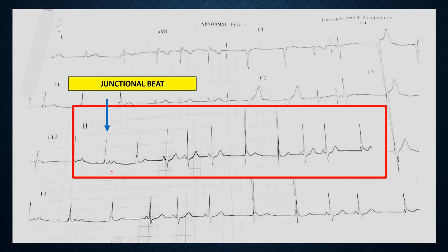Combining the different morphology, no preceding P wave, and the rate of these two beats — we can't see a P wave behind these two QRS complexes, and the RR rate is different. The sinus rate is faster. The junctional rate is around 40 to 60 beats per minute; here it was around 60 bpm. This was the junctional firing occurring because the sinus node was not taking over the conduction system.